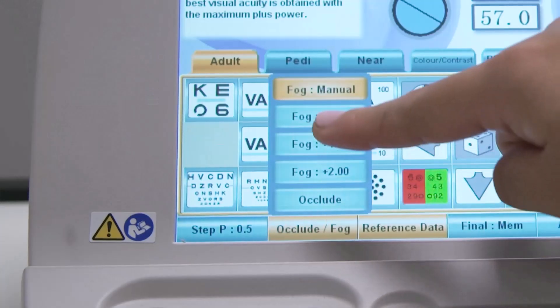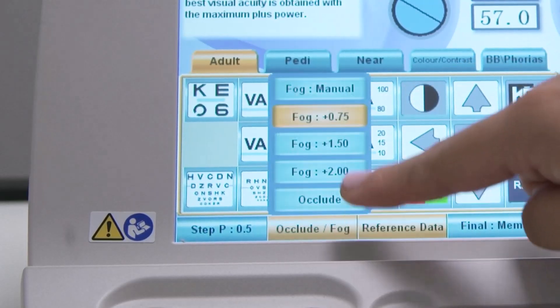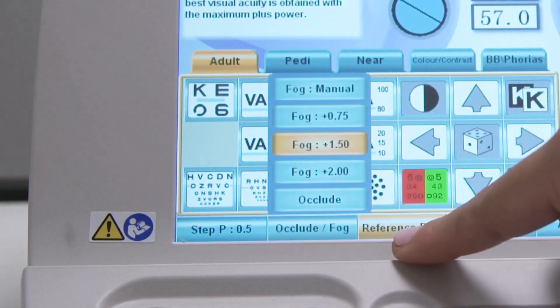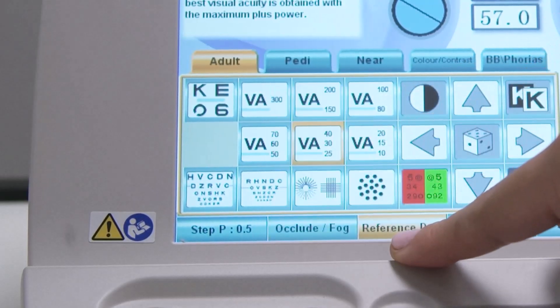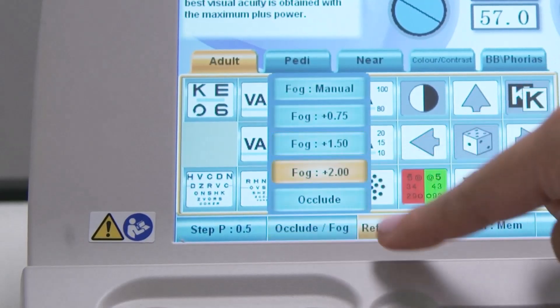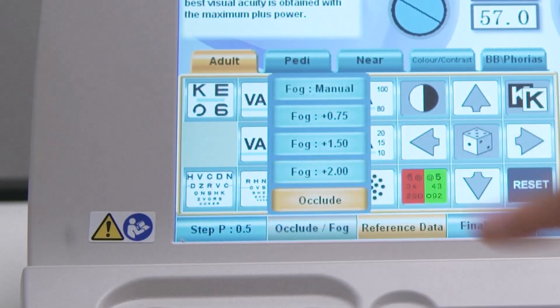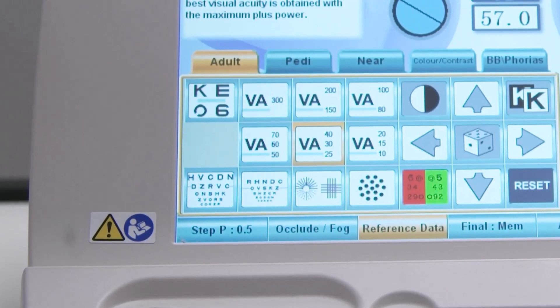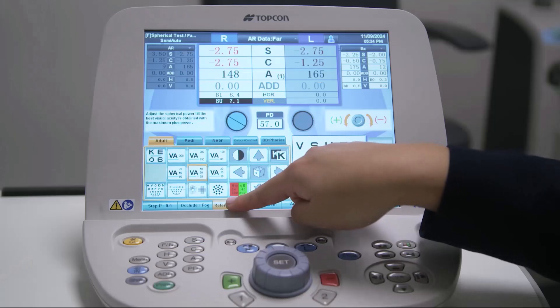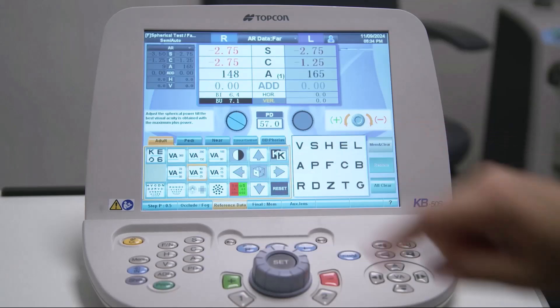The second button is Occlude Fog. When selected, it allows the user to choose between a solid occluder, a range of predetermined fogging lenses, or manual fogging of the eye that is not under test. The third button controls whether the reference data is displayed or not.